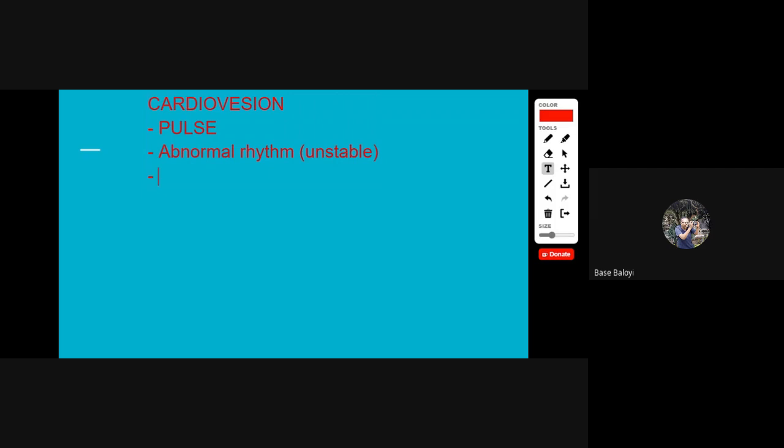And why are we giving this cardioversion? We are doing the cardioversion because we want to correct the abnormal rhythm. We want to correct their abnormal rhythm, right?